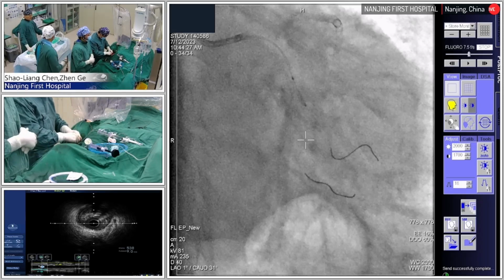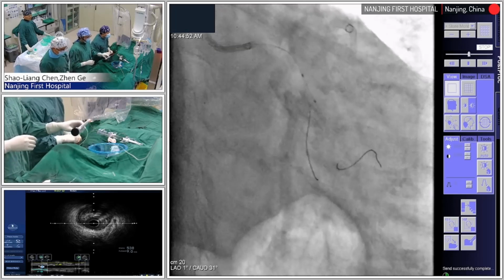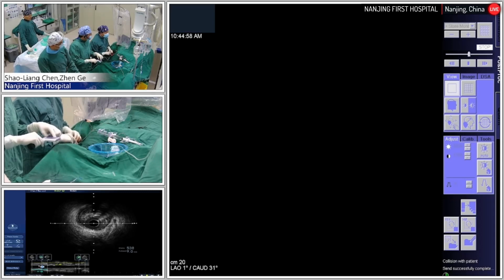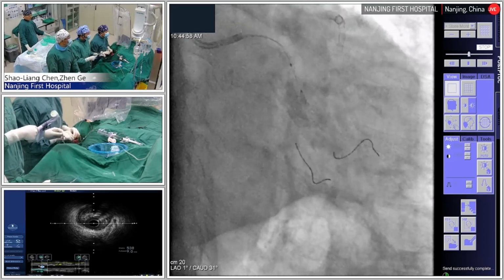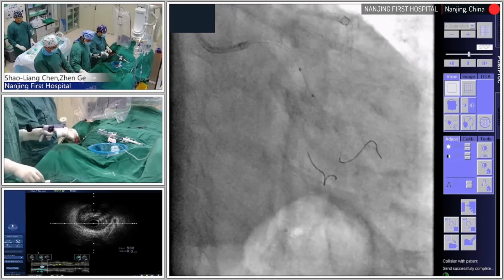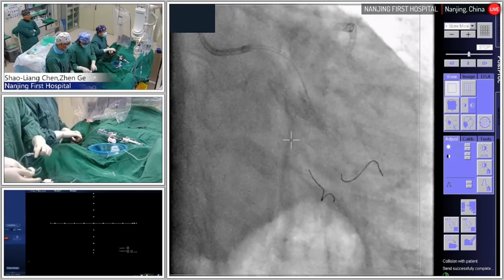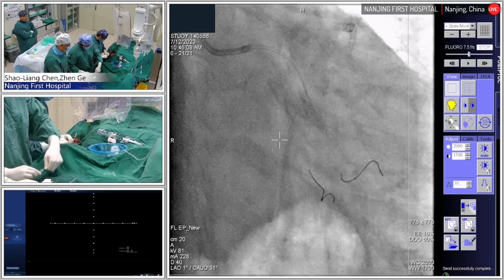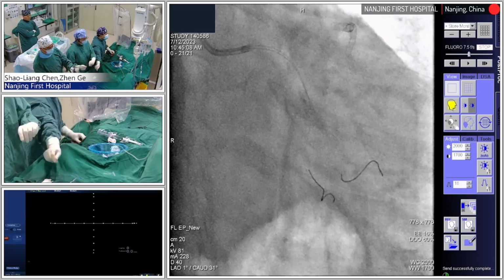So what's the stent size? Did you define it? Just 3.5, 18. I don't know, 18 is not enough. I think I need to check IVUS, to recheck the IVUS and measure. Not yet, wait a minute. Because this is the AV groove, the proximal circumflex was shortened too much.